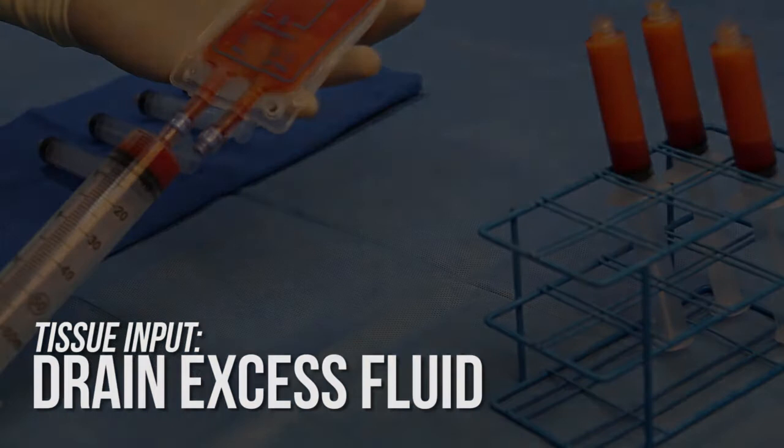After draining, more lipoaspirate may be added through the tissue wash port. To ensure the best quality graft, do not exceed 50 milliliters of post-drain tissue volume.